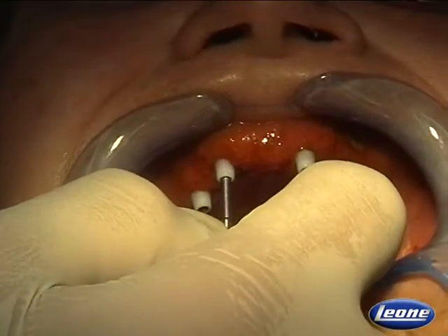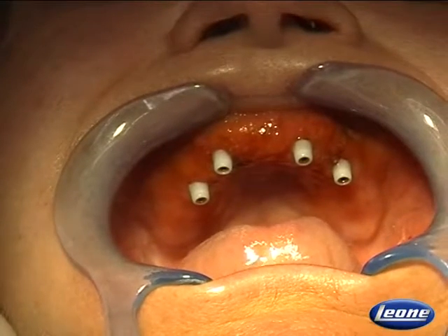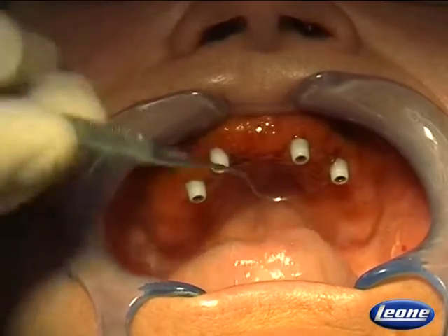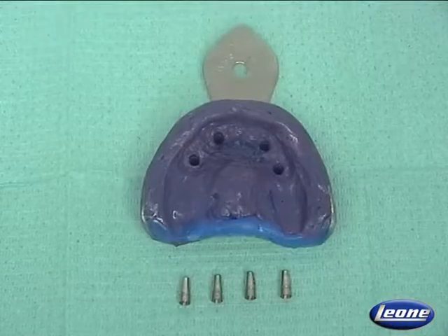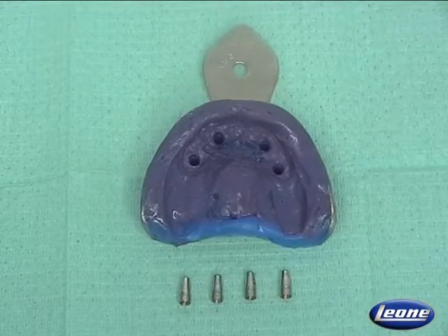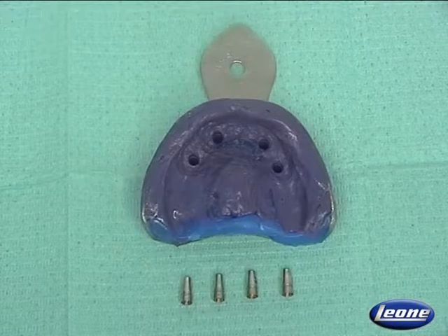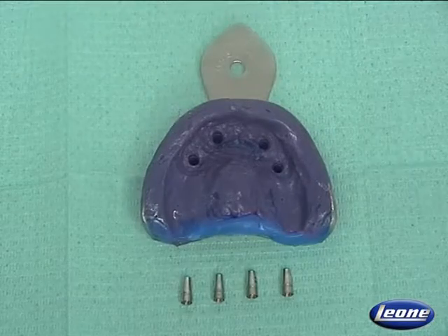Now we have to relieve the provisional denture to create space for the abutments, and then we can send the patient home. Impressions and transfers are sent to the laboratory. The dental technician will then receive the impressions, the 4 abutment analogs, and the 4 transfers.